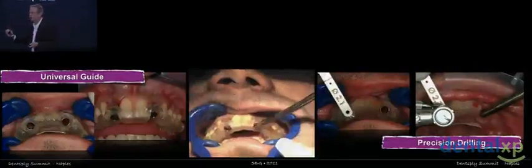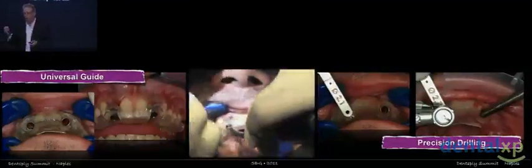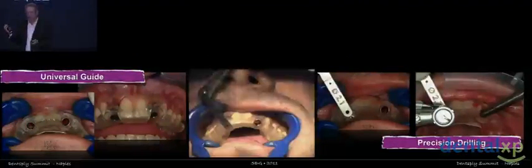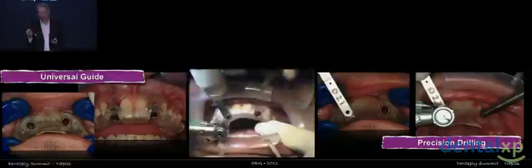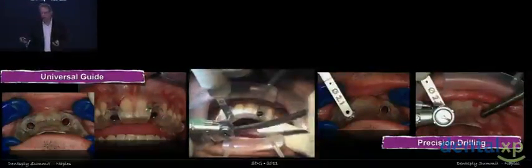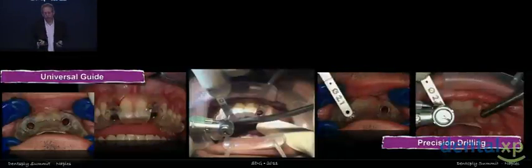We trust the technology at this point that we can utilize, in this case, the universal kit to have our drill guides, and we just go in there, and a 12-year-old can do it at this point, just about. You just have to get your drill through the hole. So this is where the culmination of the technologies allows us to have that kind of accuracy and the consistency that we want.